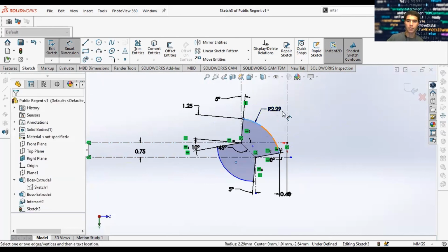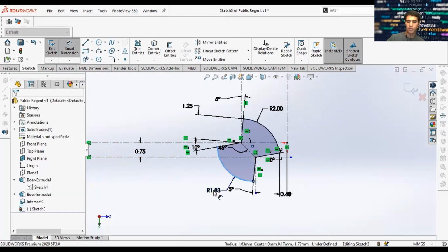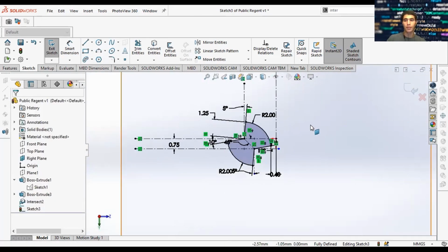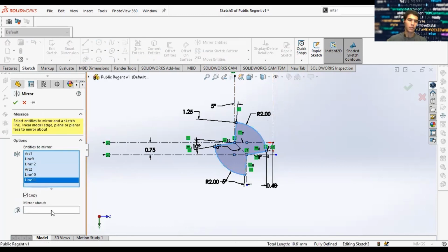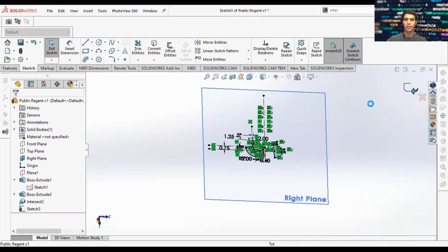Add some dimensions. It's 2 radius. Make this 2 as well. Cool. So this is our pivot, and with this hinge, we're going to be able to pivot our leaflets. Let's mirror this entire design about this axis. And then when we're good with that, let's just accept it.